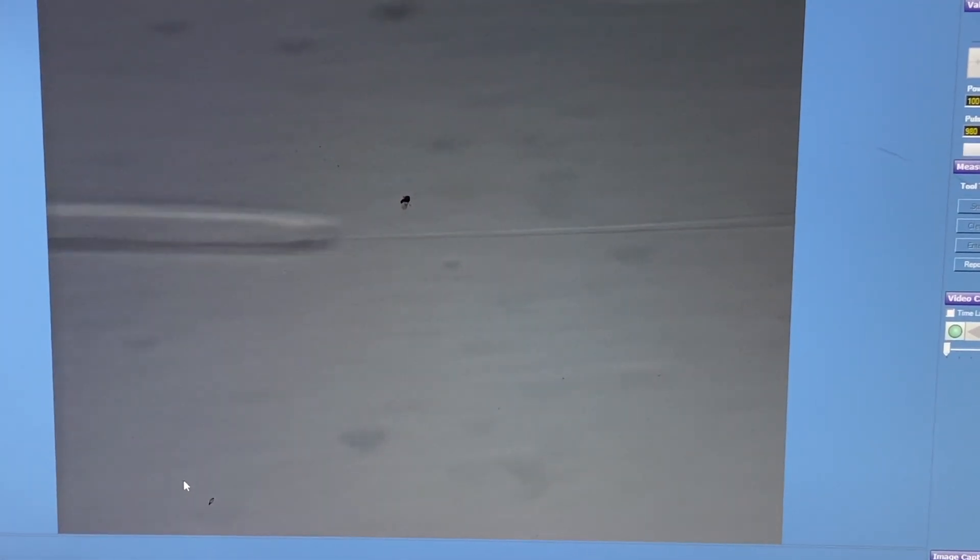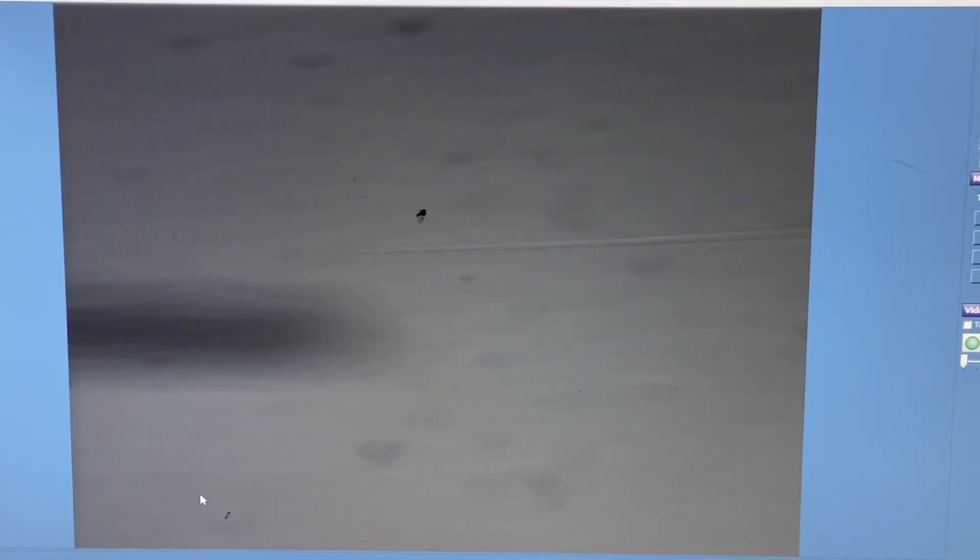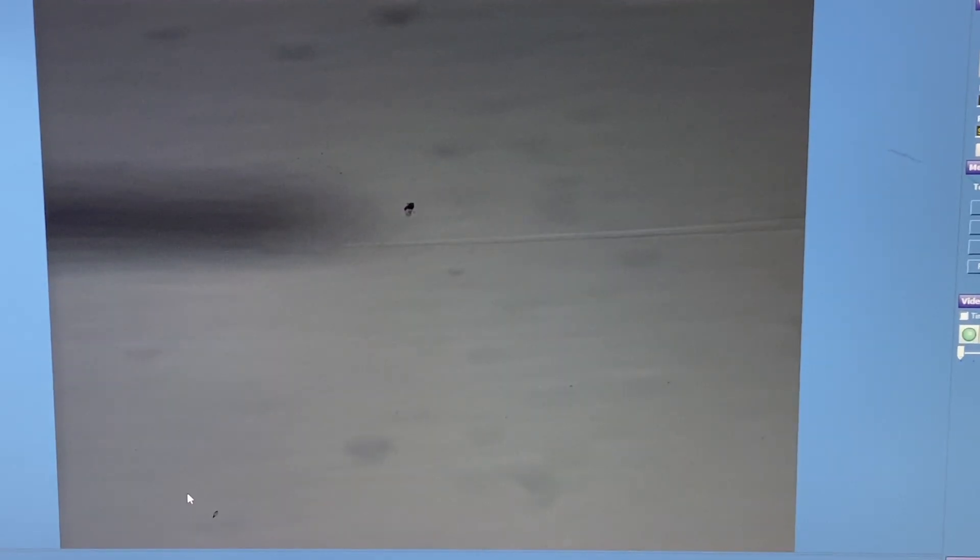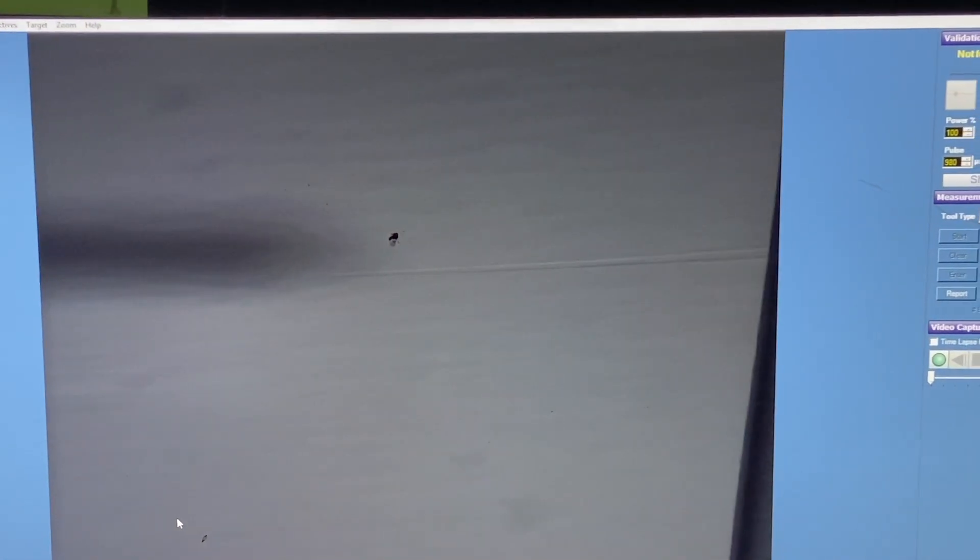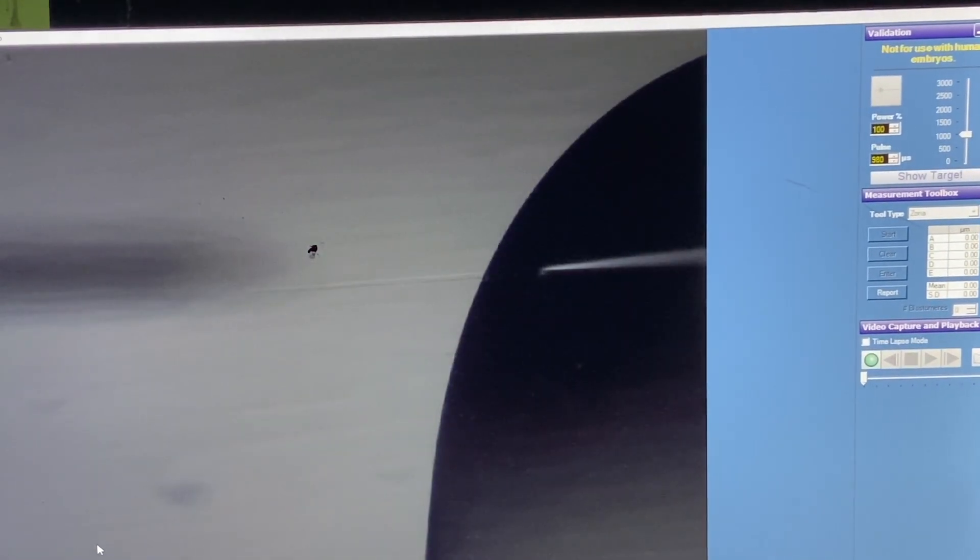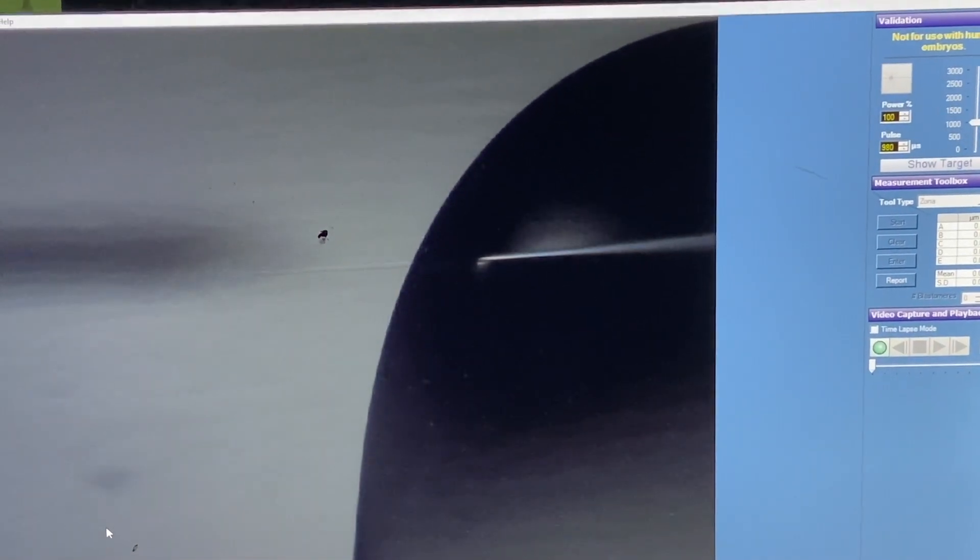Now I will take off my holding. When I mean take off that means I am taking it out of the dish. And slowly I am moving my ICSI pipette towards the PVP droplets. So if you see right now. Now my ICSI droplet is, you can see the moving of the PVP inside this needle. You see the level going up.